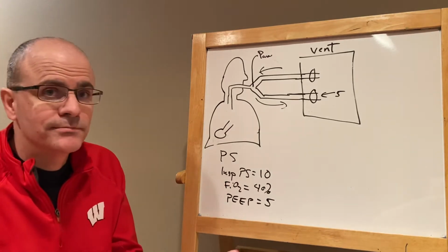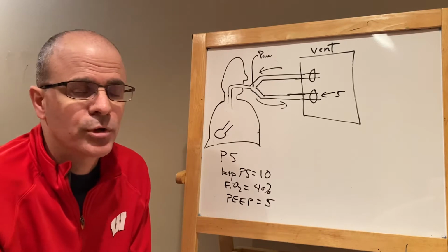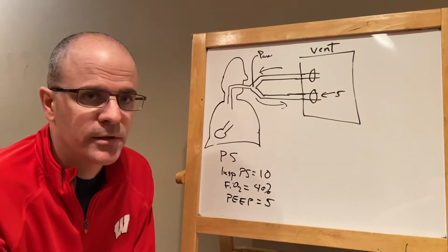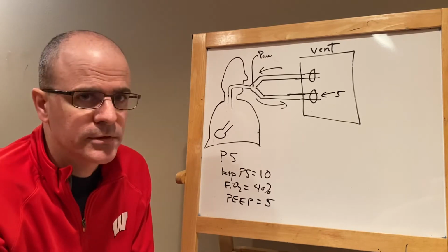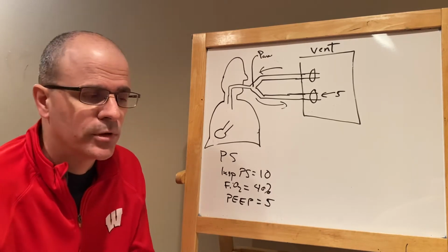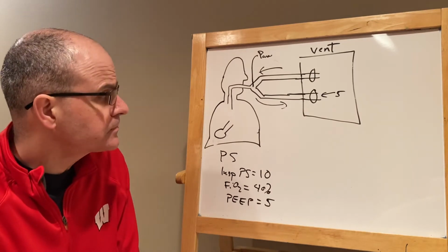With pressure support, you don't set a backup rate. There's no backup rate in pressure support. Not that there couldn't be, but that's just the way that the mode was originally, I think, thought of, as sort of a mode for people who are getting close to extubating, who don't need that sort of high-level support.